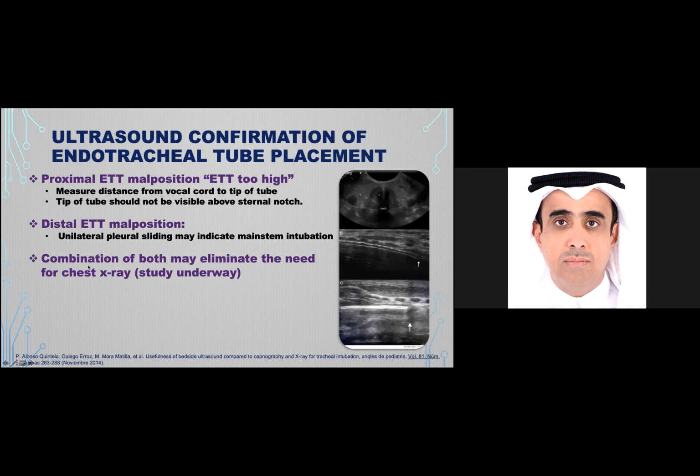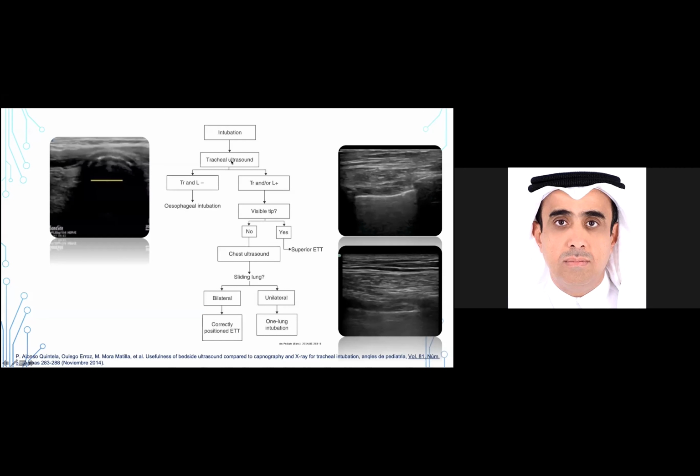Some studies use a combination of these to avoid exposing the patient to any more chest X-rays to confirm the tube in place. So if you are going for intubation, you have to be sure the tube is in the trachea, going for tracheal ultrasound.